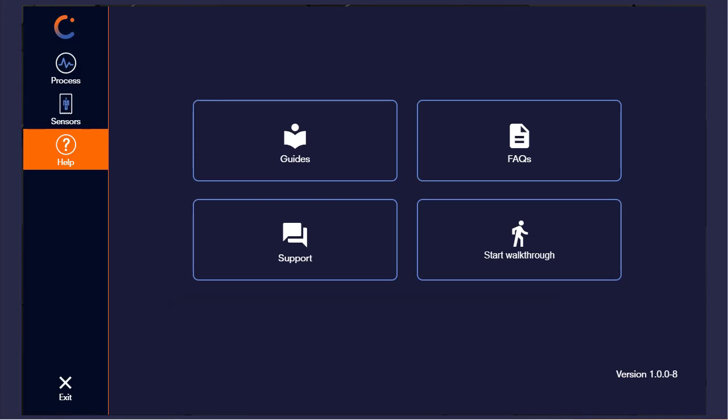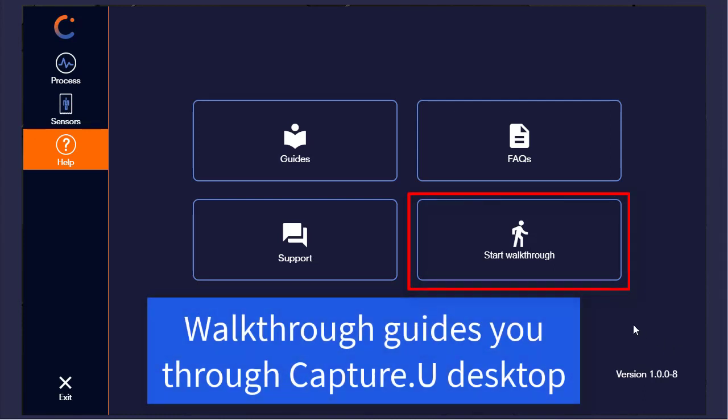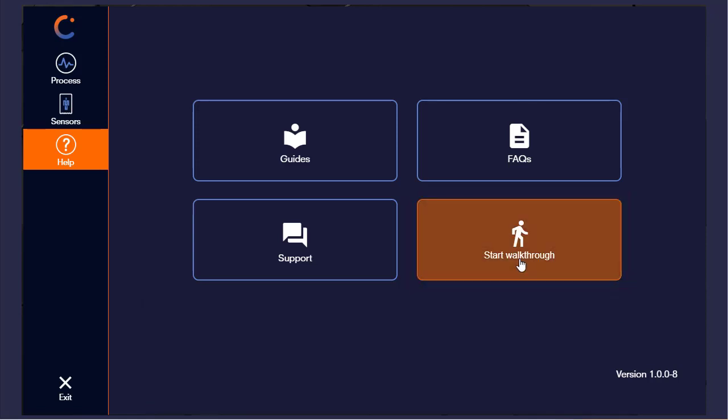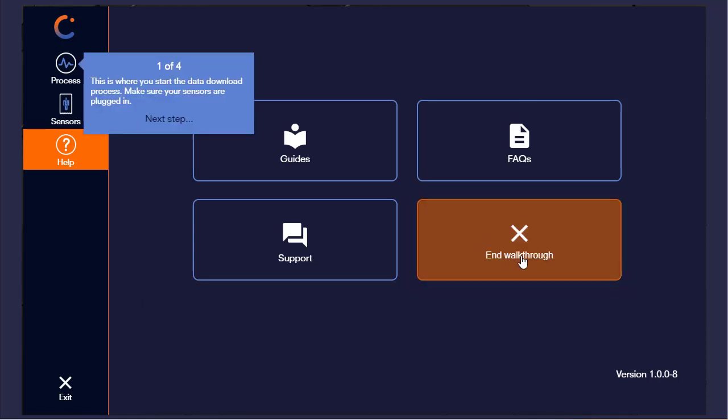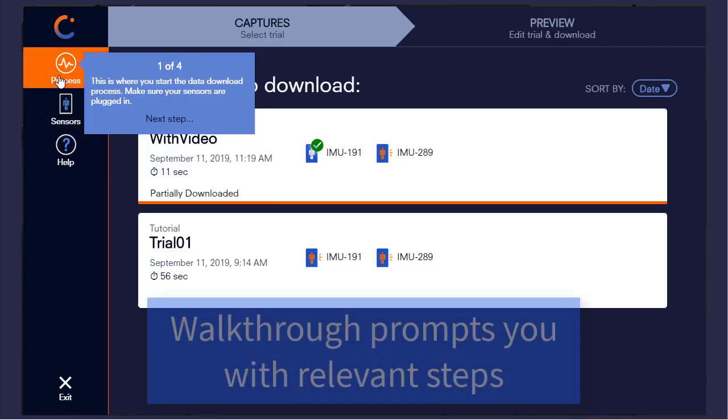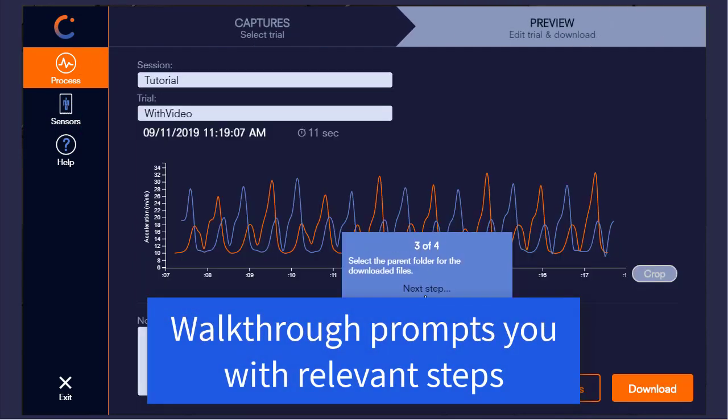The final choice is to start a walkthrough. This is an interactive guide that will walk you through the process of how to download data from your sensor. So if I click start walkthrough, it'll tell me to go to my trial list, click next step, it'll tell me to select a trial.